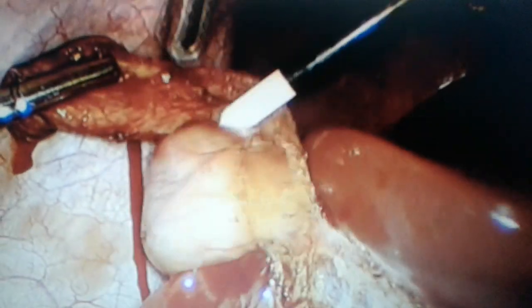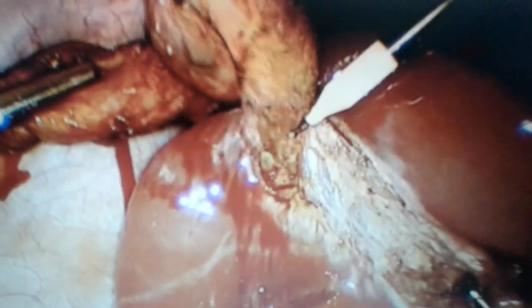Although most of the learners must be having a question in their mind: what about the spillage? Whether it is justified? No, obviously it's not justified. Ideally we should avoid it.